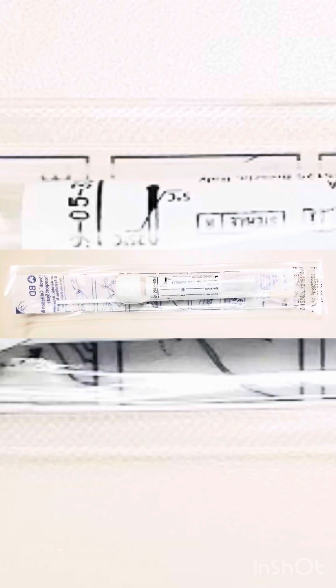This is an example of a swab collection kit. As I mentioned before, these are for superficial wound cultures. And as I mentioned, there are many different types of brands and types of swab collection kits, but each contains a transport media to help preserve the specimen. That can be a sterile saline or a type of preservative that will not deteriorate the bacteria or microbes.